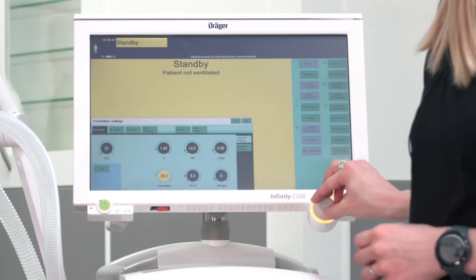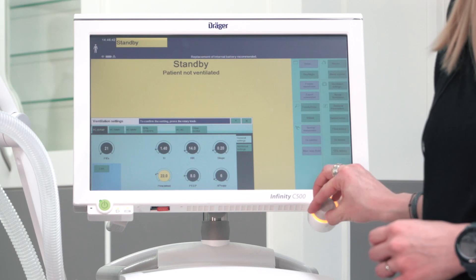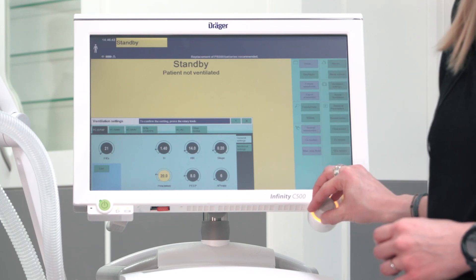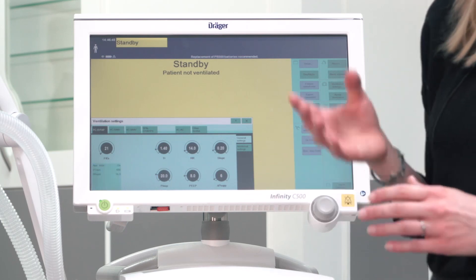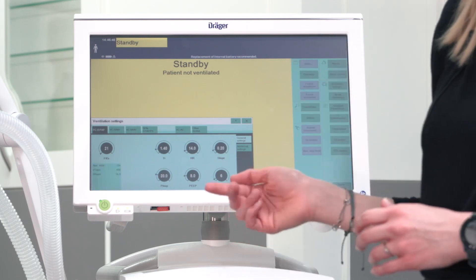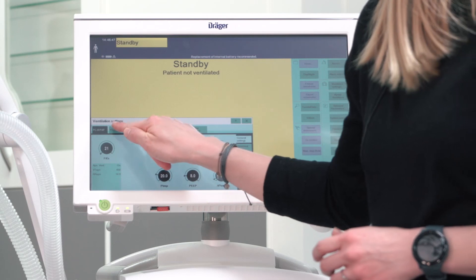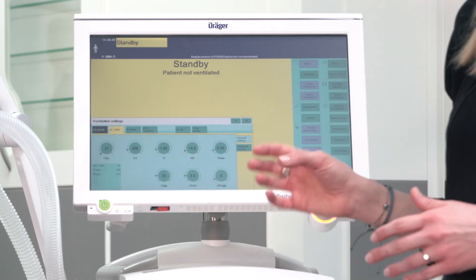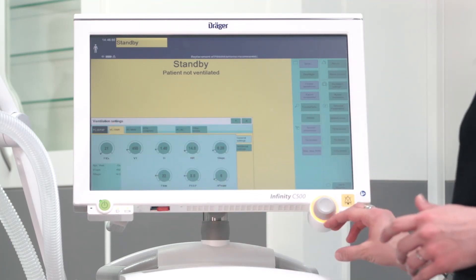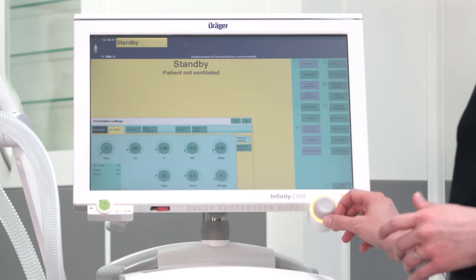To apply changes, select the related parameter, turn it to the desired value, and confirm with the rotary knob. If you want to change the ventilation mode, select the respective ventilation mode and confirm with the rotary knob.